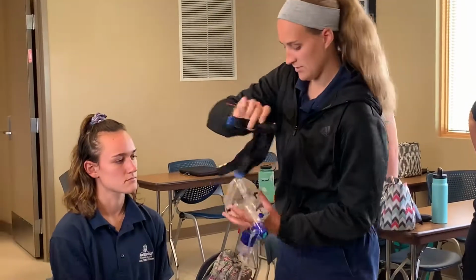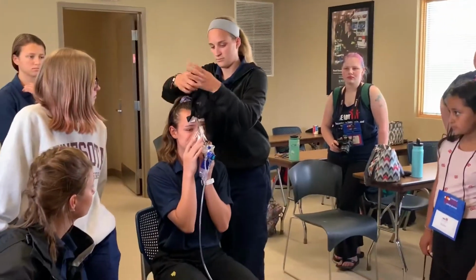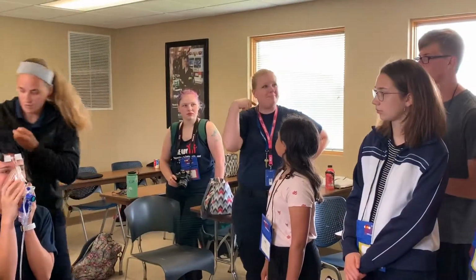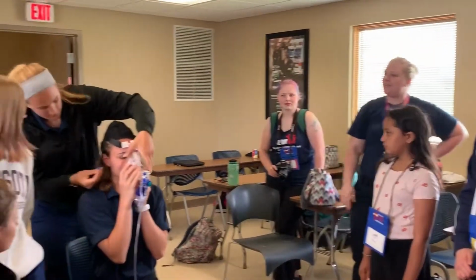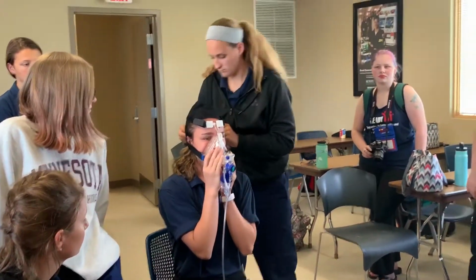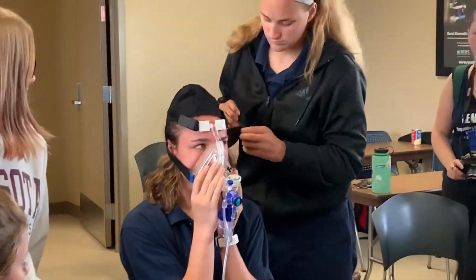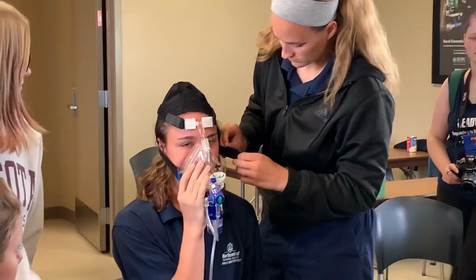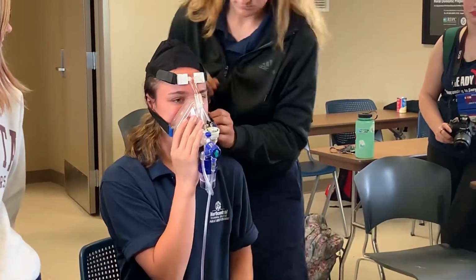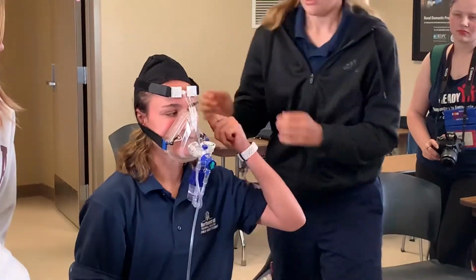So I'm going to have you hold it to your face. Now, we've been practicing, so they're already used to securing the mask on there right away. Do you feel air coming out, or does it feel good? Feels good?